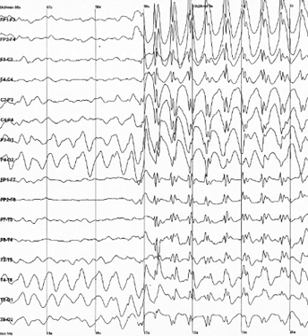The theoretical definitions have always been more carefully defined to include all frequencies. Unfortunately, there is no agreement in standard reference works on what these ranges should be. Values for the upper end of alpha and lower end of beta include 12, 13, 14 and 15. If the threshold is taken as 14 Hz, then the slowest beta wave has about the same duration as the longest spike, 70 milliseconds, which makes this the most useful value. Others sometimes divide the bands into sub-bands for the purposes of data analysis.